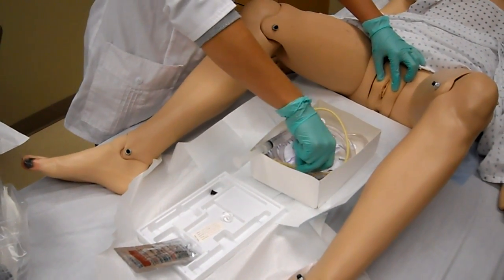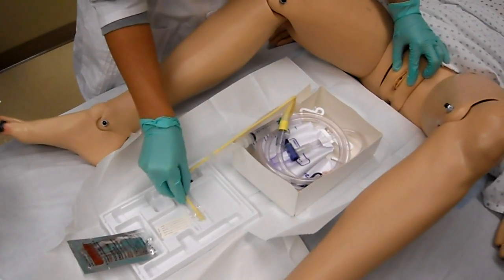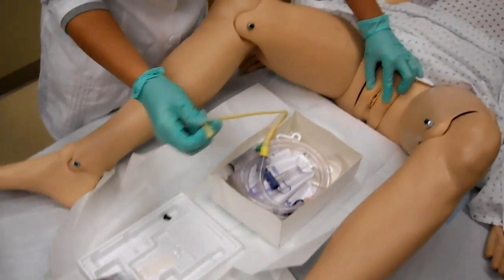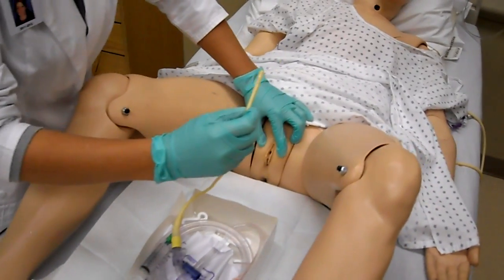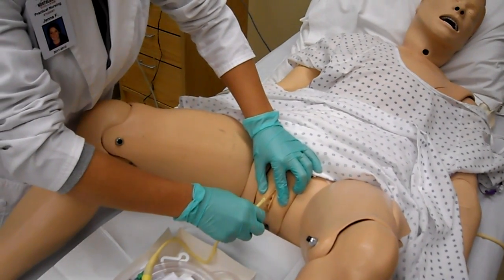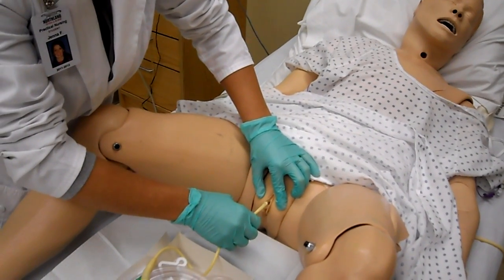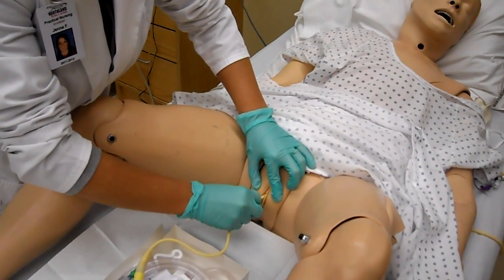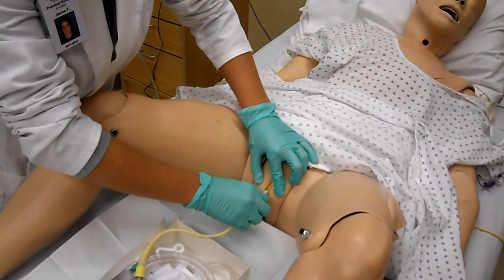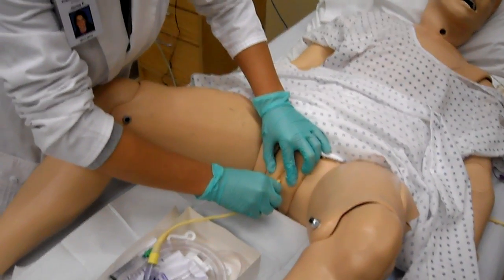You're going to take your catheter and put the lube on the tip about two to three inches. Have your patient take a deep breath, and as they breathe out, you're going to insert. With the tip, point it upward so it doesn't slip. Insert it about three to four inches until you get urine back into the catheter, then insert it about another inch to make sure you're in the bladder.